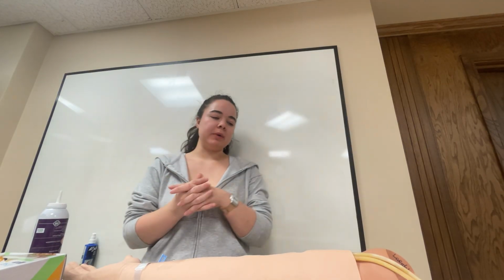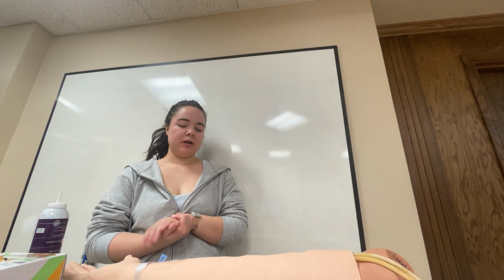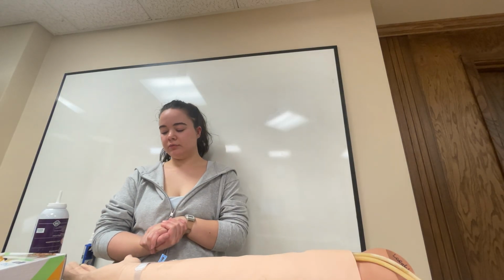At this point, I'm going to be reviewing my provider's orders. I'm going to be entering my patient's room, performing hand hygiene, providing patient privacy. Hello, I'm Marielle. I'm your nurse. I'm going to be giving you some Benadryl via your saline lock on your right arm. Do you have any questions at this time?